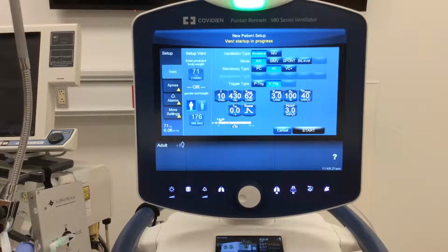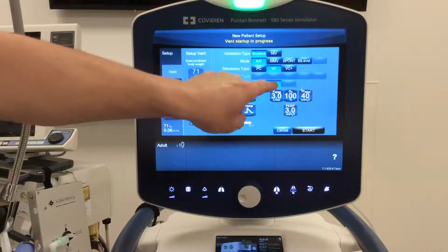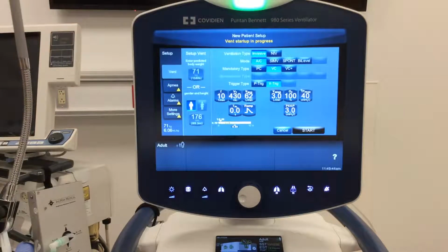Any time we would encounter a situation where we don't want that patient to actively breathe, it would be cruel and inhumane to do so by disabling their ability to trigger breaths. We need to do that through pharmacological sedation and paralysis, and we'll talk about the benefits of that a little bit later on. So you have the option on both. Flow triggers, the V-trig, are more sensitive or a little bit more responsive. However, I will say with these newer modern ventilators, pressure triggering, if you set that value at -1, -2 centimeters of water, it is quite responsive as well.